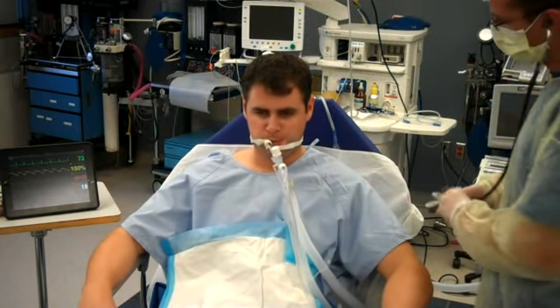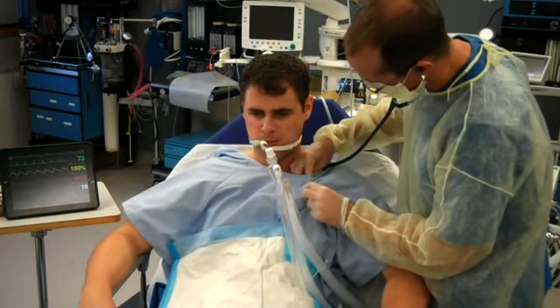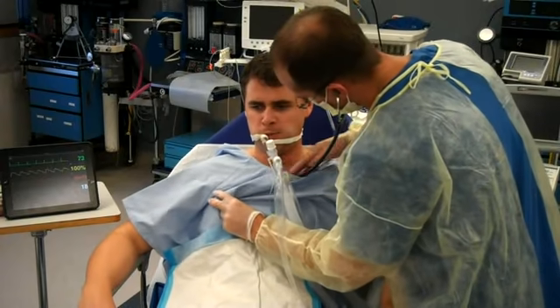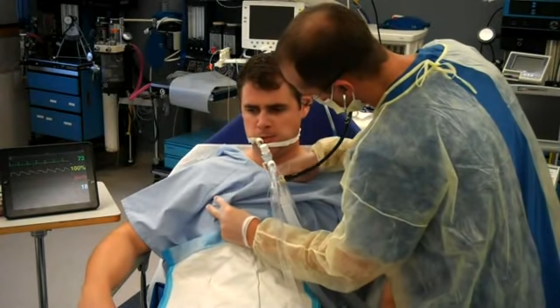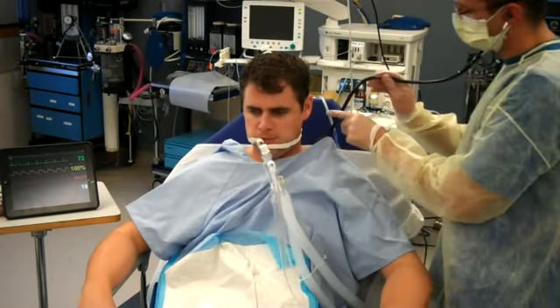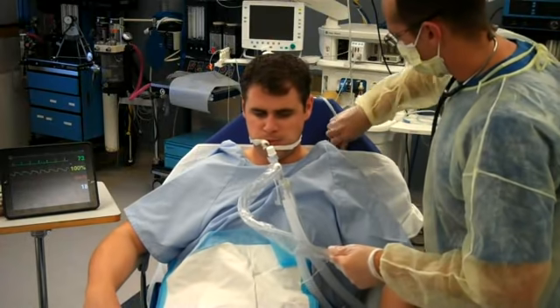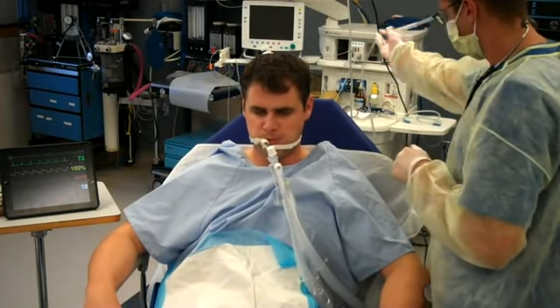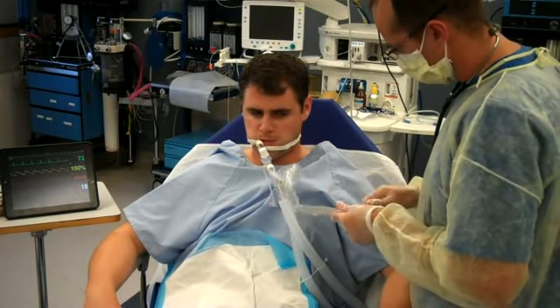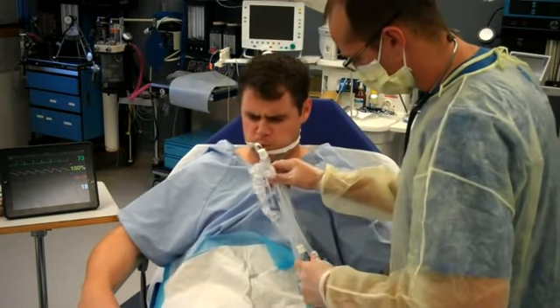I'm going to have a quick listen to your breathing. I'm going to come into your shirt here. Sounds like you've got some stuff down in your lungs. I'm going to go ahead and just clear some of that out — I'm just going to make you cough a little bit. You're going to feel it at the back of your throat and you might cough a little bit. That's a big cough.